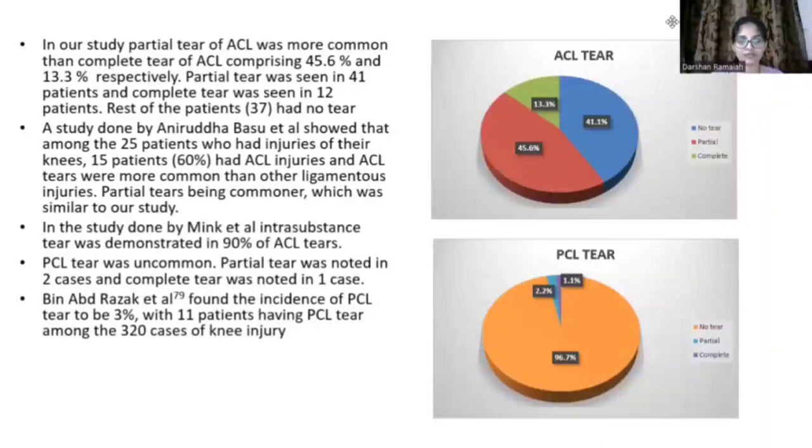In our study, partial tear of ACL was more common than complete tear of ACL, which constitute 45.6% and 13.3% respectively. The partial tear was seen in 41 patients and complete tear was seen in 12 patients. The rest of the patients had no tear.